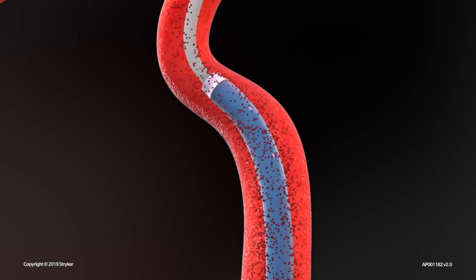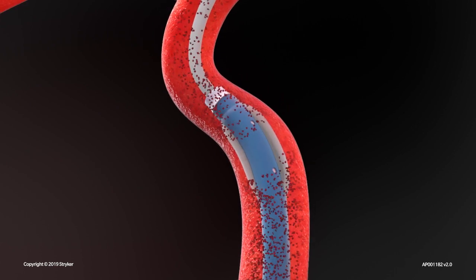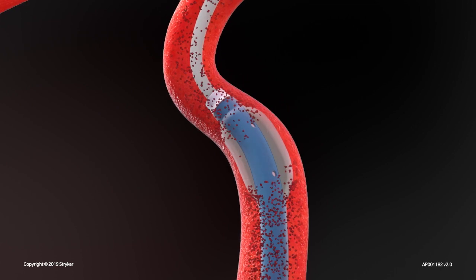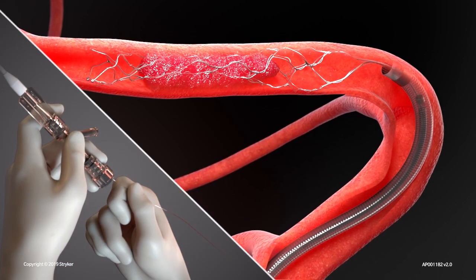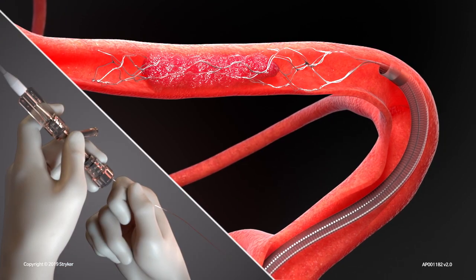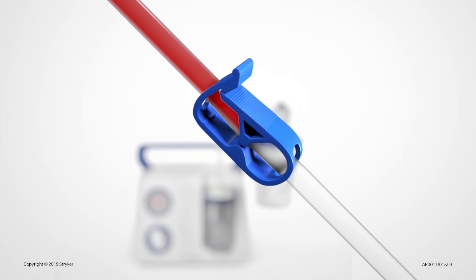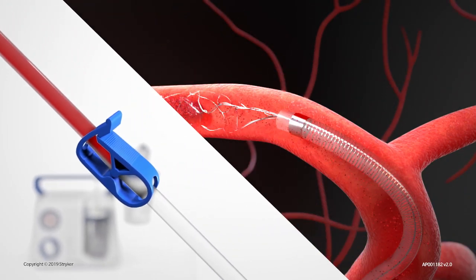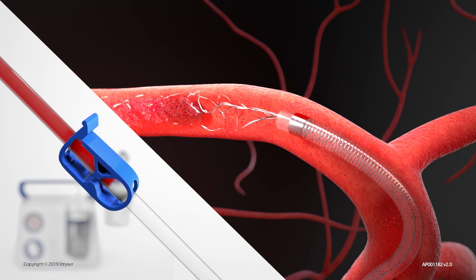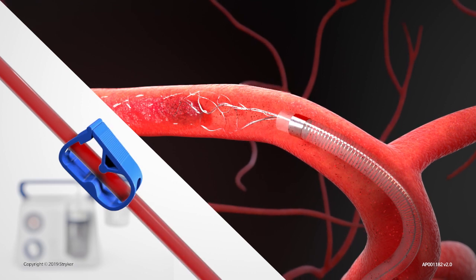Prior to retrieval, the balloon guide catheter is inflated to control proximal flow. The microcatheter may be removed to allow for a larger channel for aspiration. Connect the aspiration tubing to the access catalyst distal access catheter and open the tubing clamp to initiate aspiration.